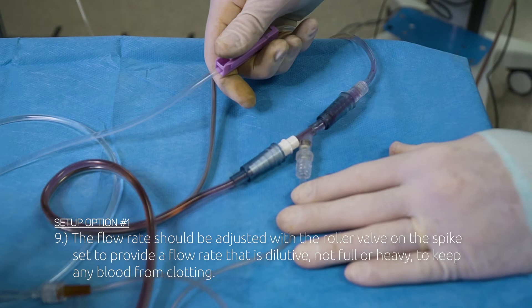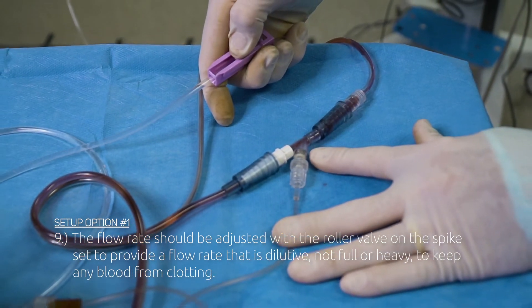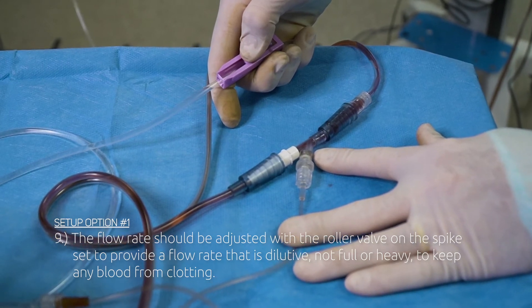Step 9: The flow rate should be adjusted with the roller valve on the spike set to provide a flow rate that is dilutive, not full or heavy, to keep any blood from clotting.